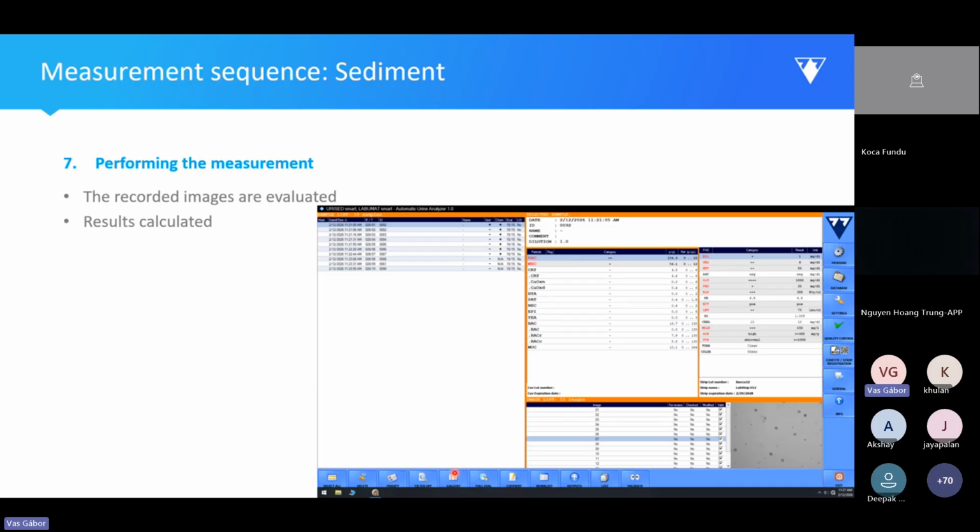This feature is also very useful for troubleshooting. Say the microscope lens are dirty, and you will always see that dirt on the same image from each sample. So I find it a very, very useful feature.